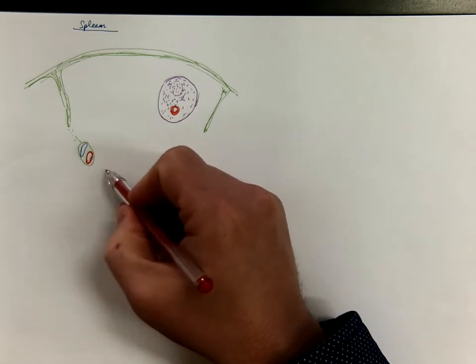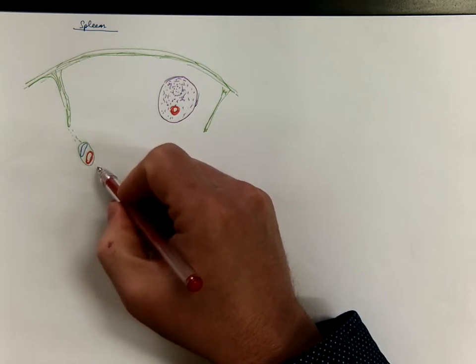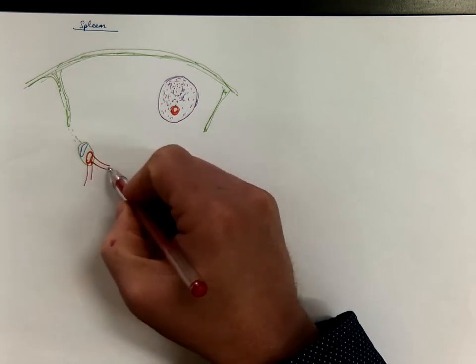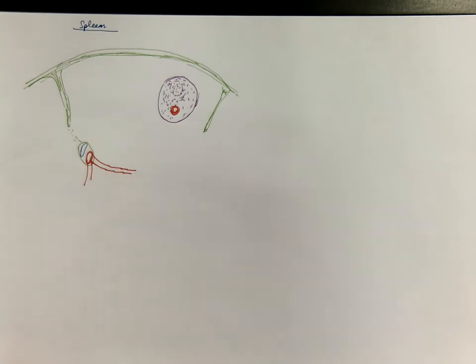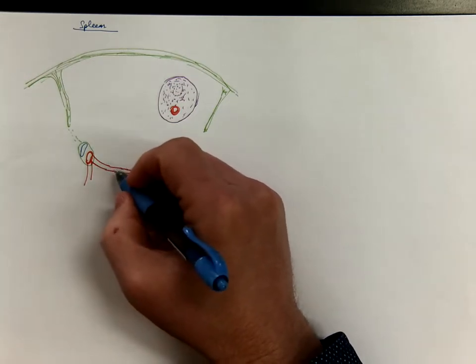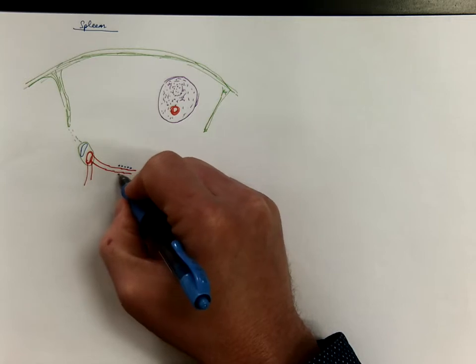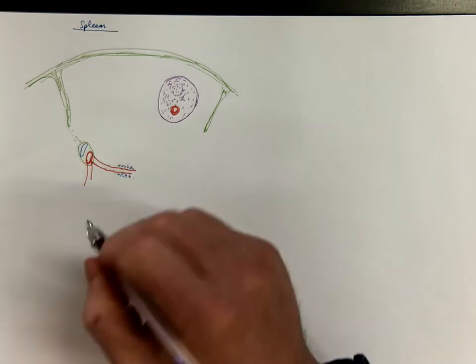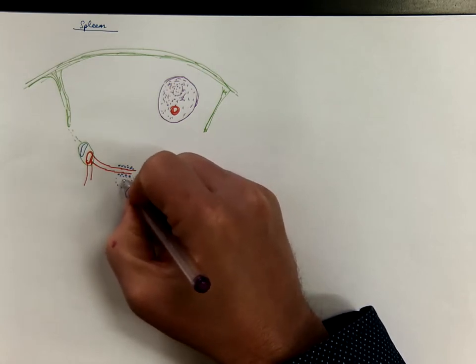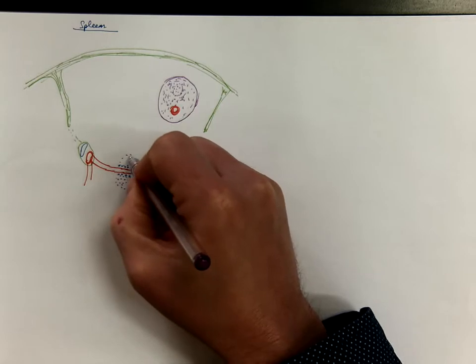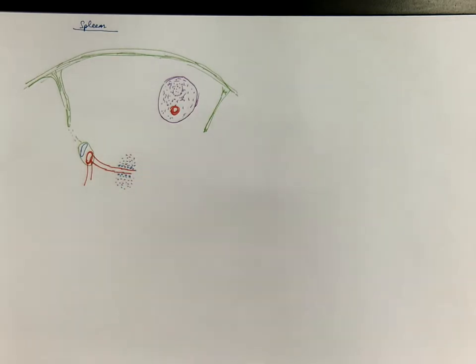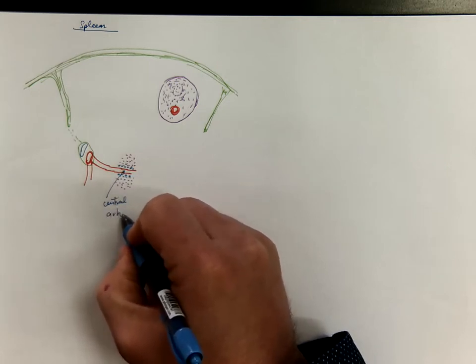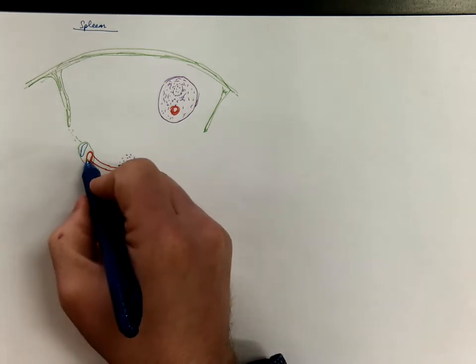Now let us follow the branching pattern of the trabecular arteries, which are branches of the splenic artery. This artery becomes surrounded by a sheath of lymphocytes — T-lymphocytes. And there is another population of B-lymphocytes. Of course they look the same in routine staining. This is called a central artery, and it's a branch of a trabecular artery.